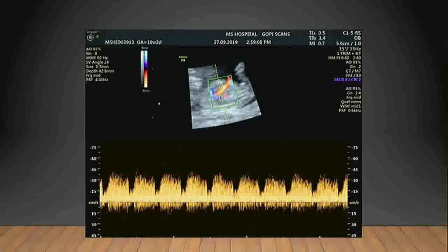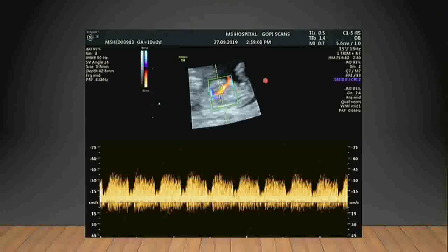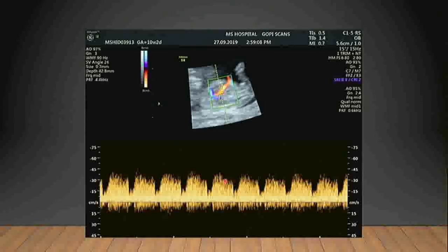Here I have taken a Doppler of the ductus venosus. You can see the umbilical vein joining the IVC. The ductus venosus is slightly angulated, so I have applied an angle correction of 24 degrees. With this correction, I am getting a perfect waveform of the ductus venosus with a normal S wave, D wave, and A wave.